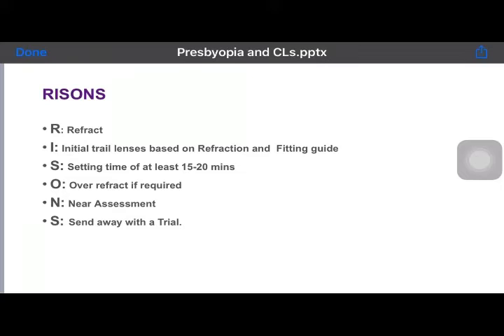At least you get a center distance from SEED, you get a center near from Cooper, you can try that as well. But the base design, rightly identified by you, is a center distance in the dominant eye and a center near in the non-dominant eye. Otherwise, it can sometimes create halos, glares, and ghosting of images depending on the patient's pupil. It does happen like that.